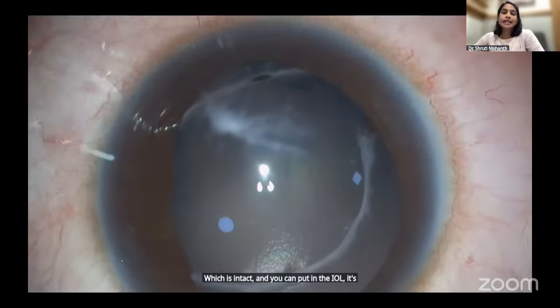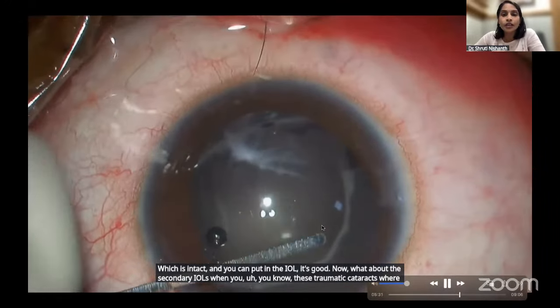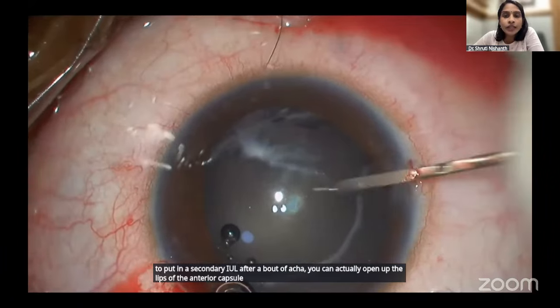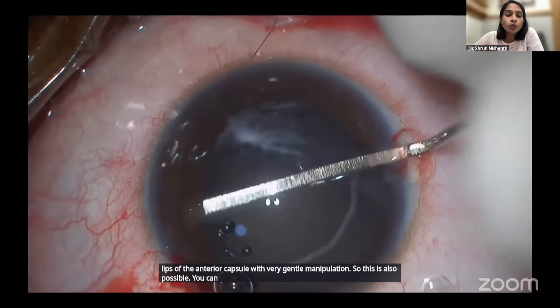Now, what about secondary IOLs in these traumatic cataracts, where you want to put in a secondary IOL after a bout of aphakia? You can actually open up the lips of the anterior capsule with very gentle manipulation. So this is also possible. You can inject some OVD into the gap.